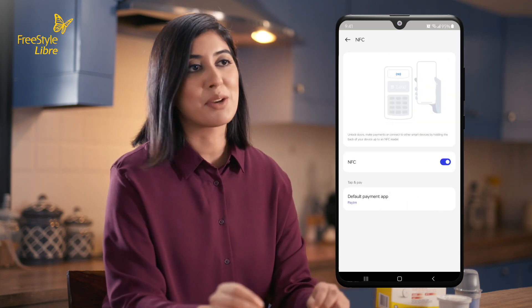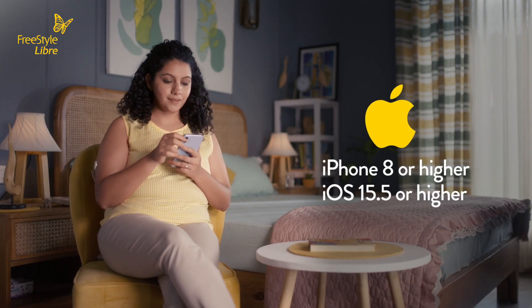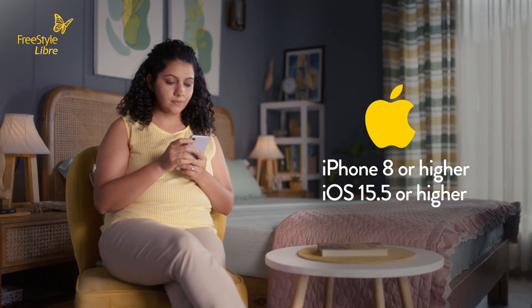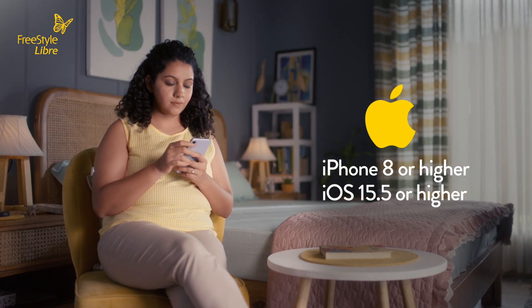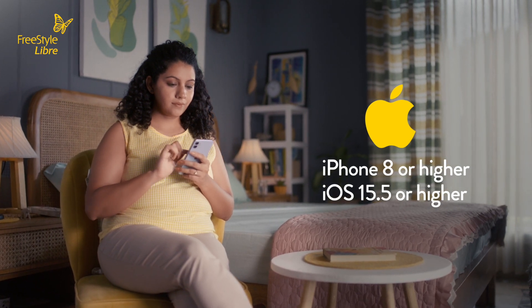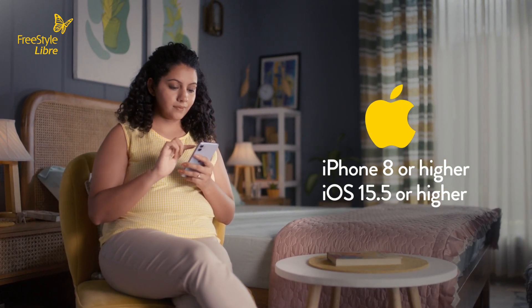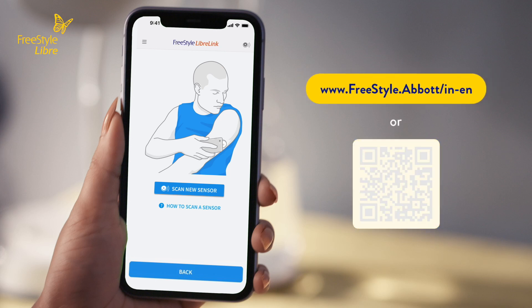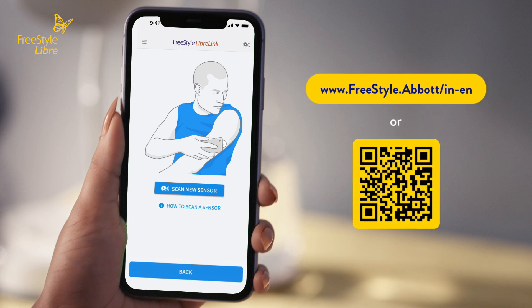For iPhone users, you must have an iPhone 8 or higher running iOS 15.5 or higher to utilize the NFC capability needed to scan the Freestyle Libre sensor. Please visit the Freestyle Libre website or scan the QR code to see the latest compatibility guide.